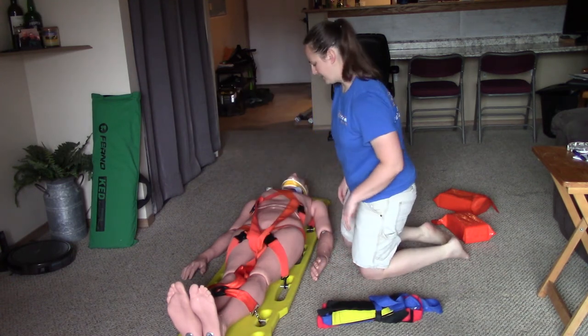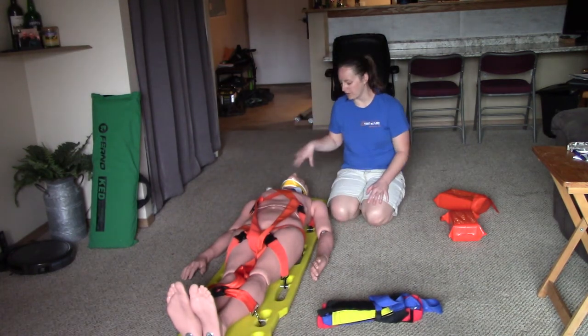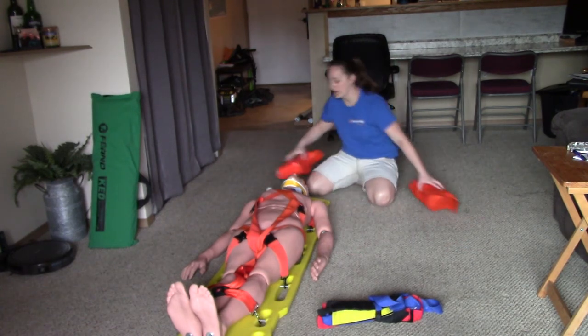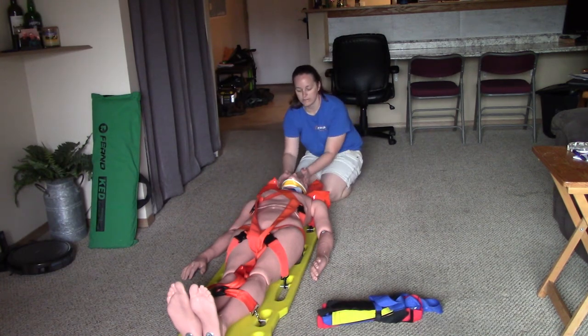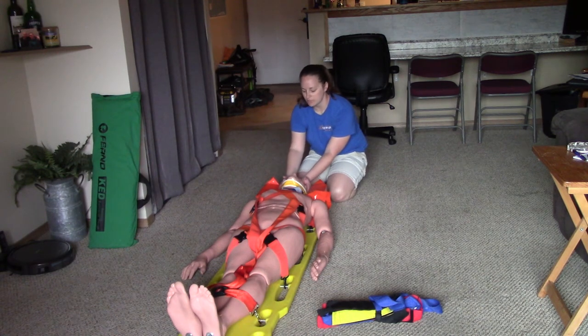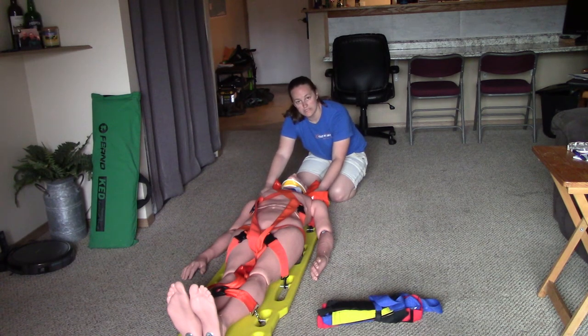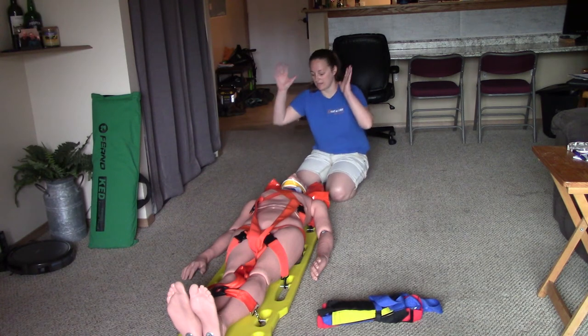The next major step is securing the patient's head. I'll put the head blocks on either side. My imaginary partner is still holding c-spine with their hands. I'll place the blocks, then my imaginary partner slides their hands out and takes over holding the head blocks, maintaining c-spine. They verbalize that they've taken over c-spine, and I can now let go.